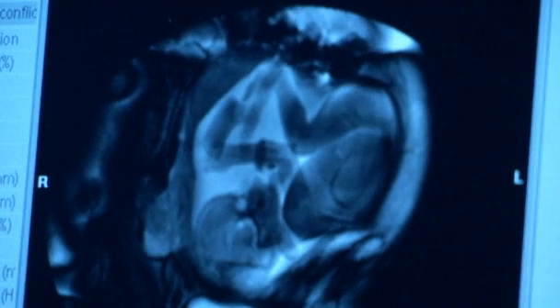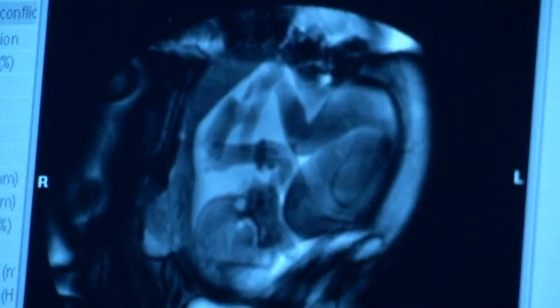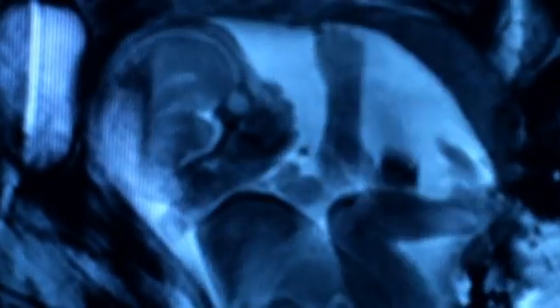Despite the striking clarity offered by these scans, Taylor-Clark doesn't advocate their use for routine pregnancies like Stephanie's. I think MRI scanning is a very specialised technique, and the vast majority of women have healthy pregnancies without any problems and deliver well, healthy babies. And if we were to scan all pregnant women, we would pick up a very, very small number of abnormalities and potentially pick up some things that we didn't quite know how to interpret that might be quite stressful for some mothers.